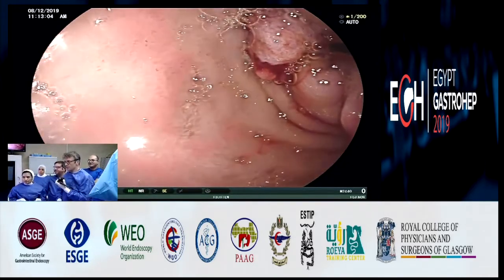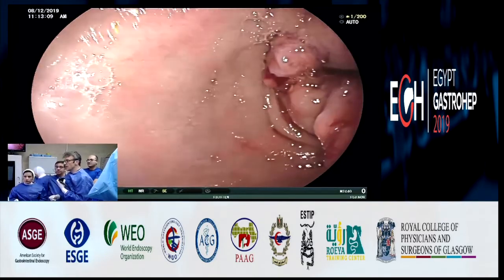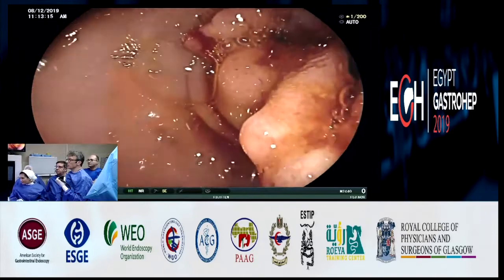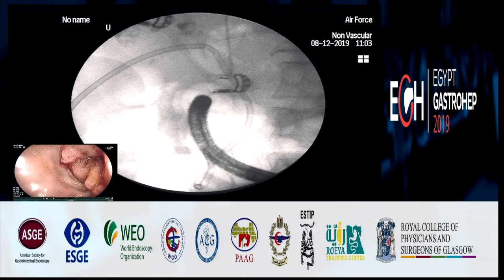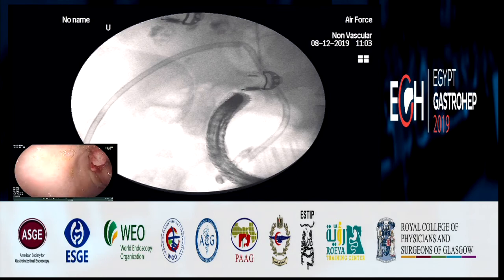So the situation of this patient is a stricture at the level of the duodenum, as you can appreciate already from the endoscopic point of view, and probably thanks to the tube that was placed percutaneously, there is already some flow coming from the bile. So I was using a colonoscope from Fuji here. It could be of interest because when you have a very heavily decompensated stomach, it could be of use to have a longer endoscope.